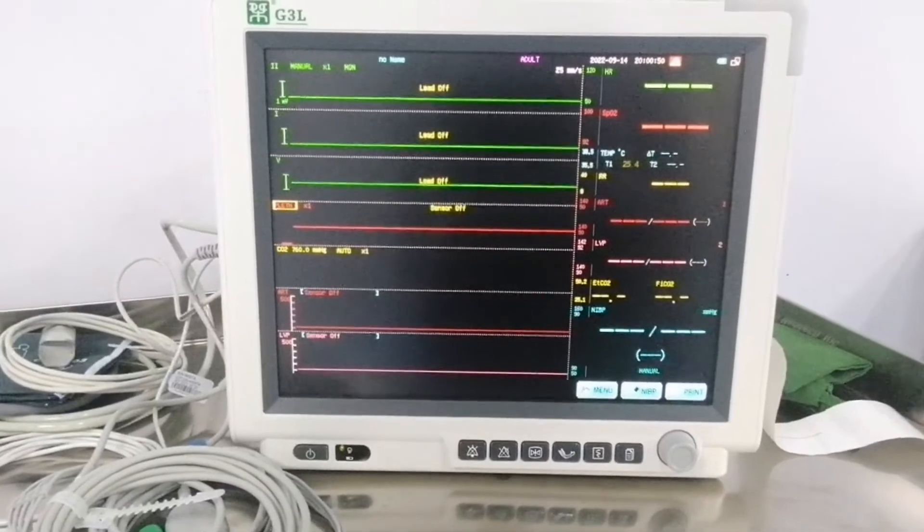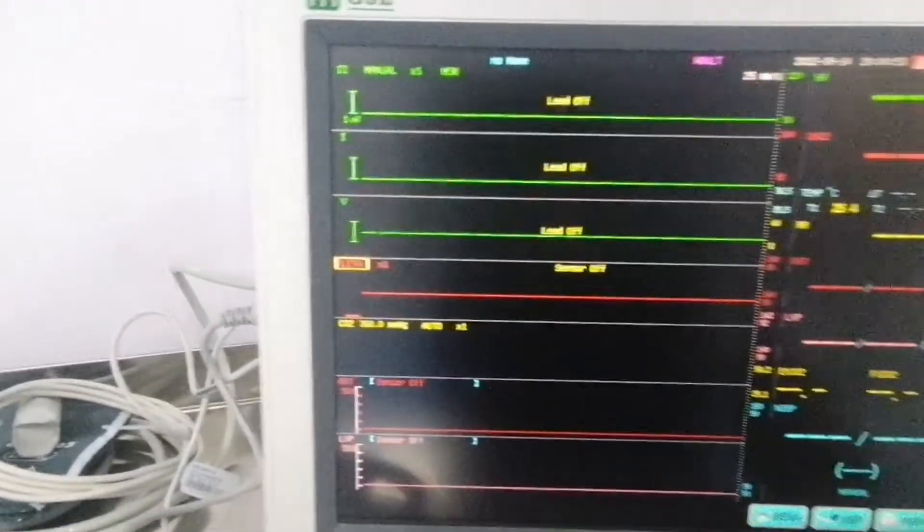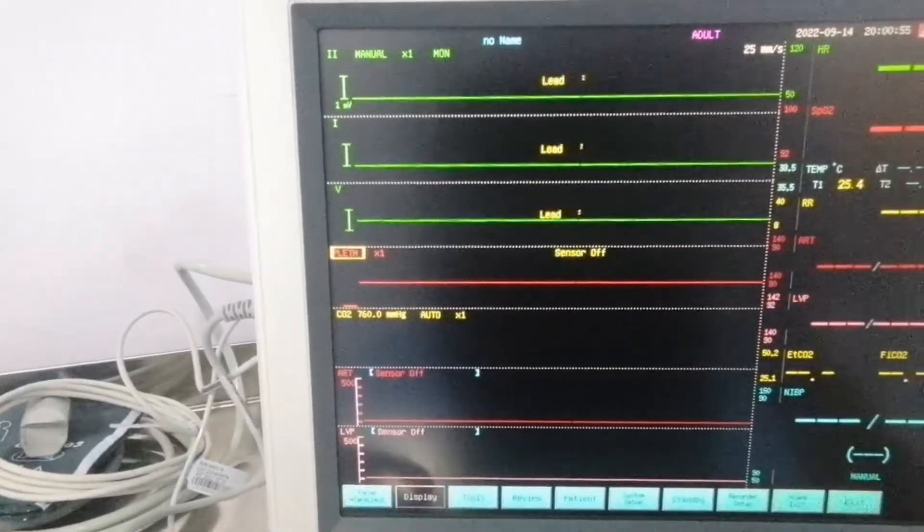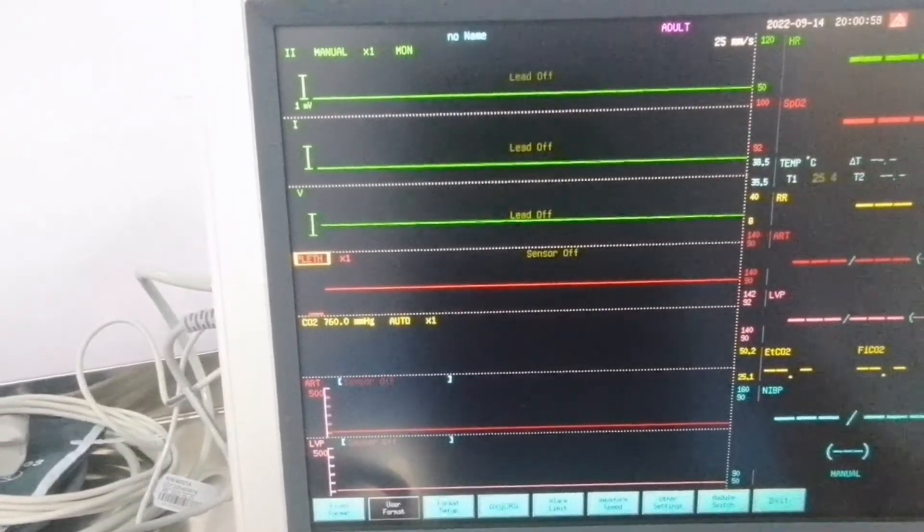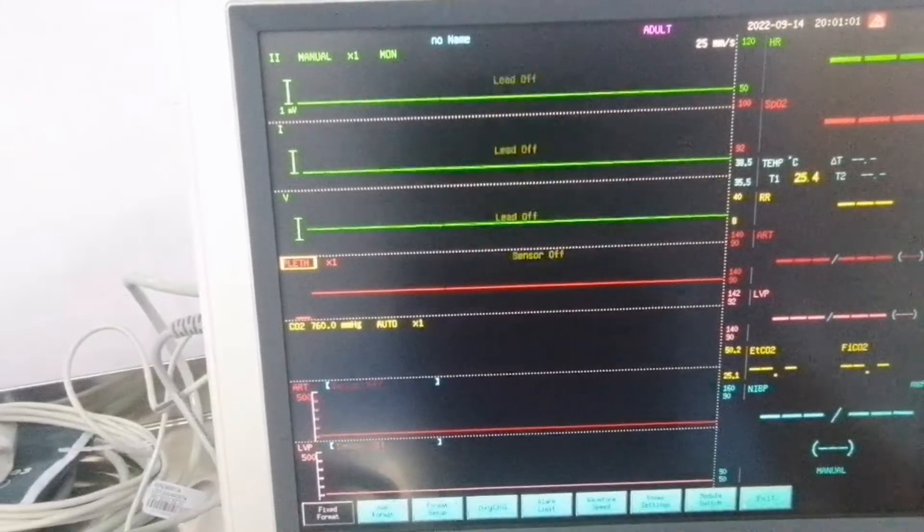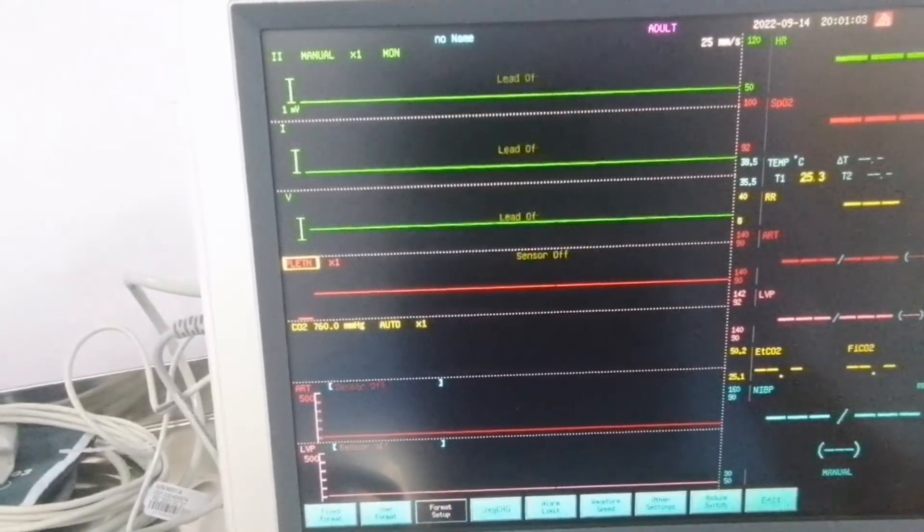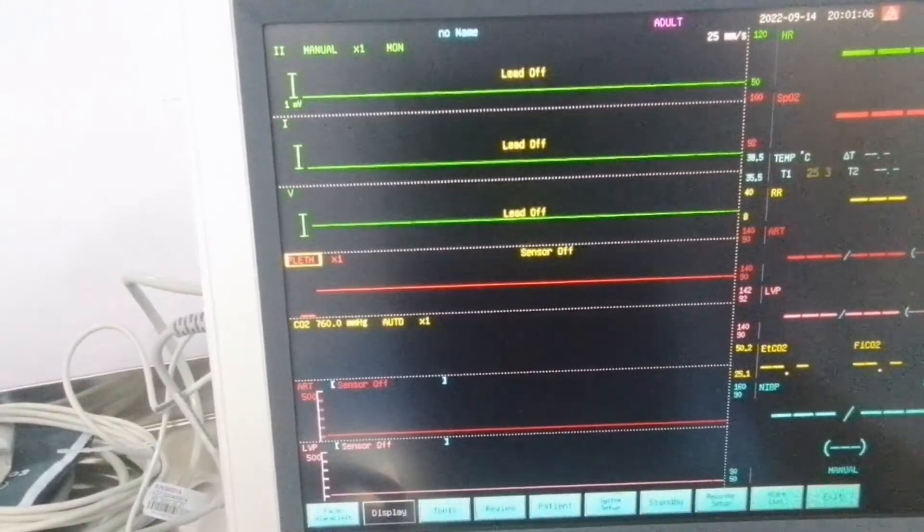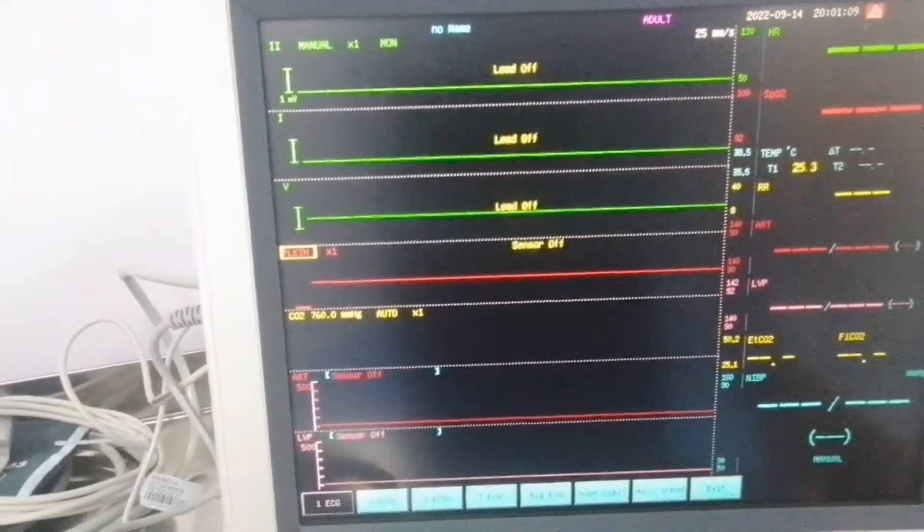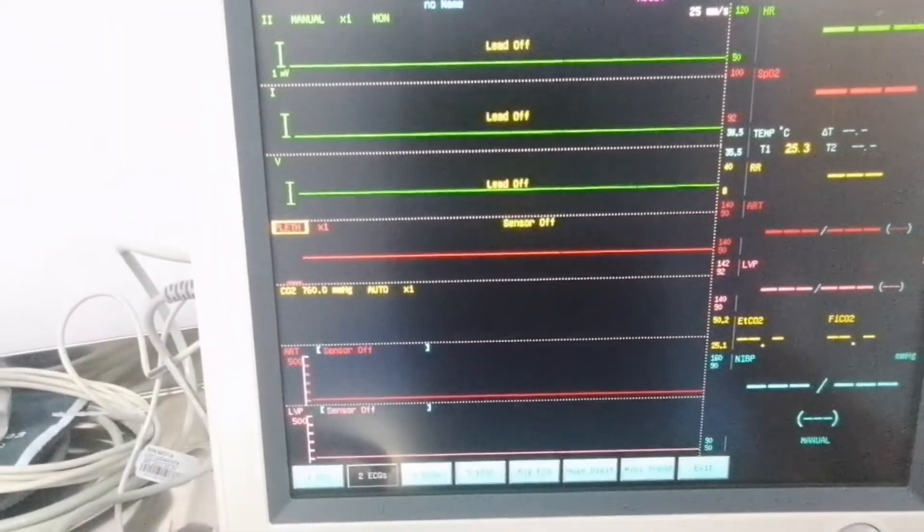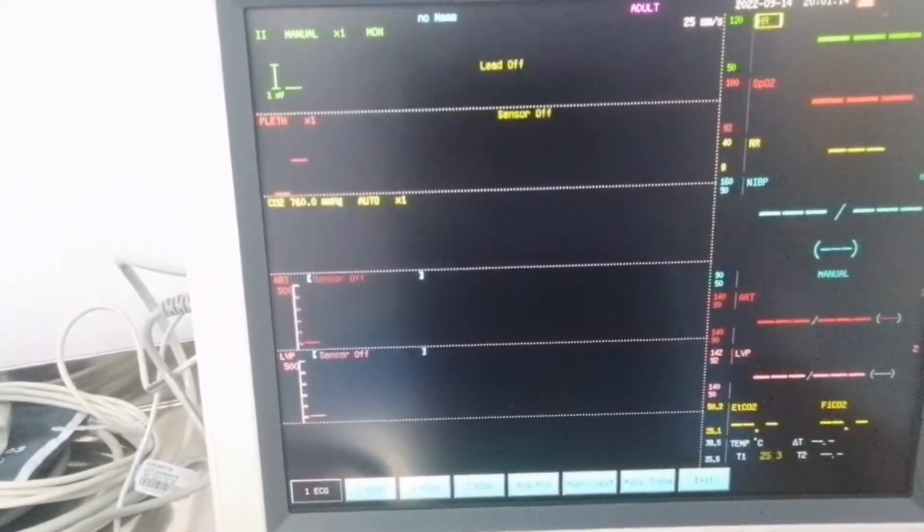I will show you how to change the display menu of the cardiac monitor. Let's go to the display monitor menu and press on display. Here are the different parameters like fix format, user format and format setup. So first we will go to fix format. Here is ECG, 2 ECG, 3 ECG, 7 ECG. Like I press the 1 ECG.